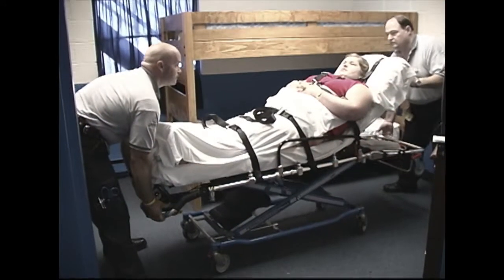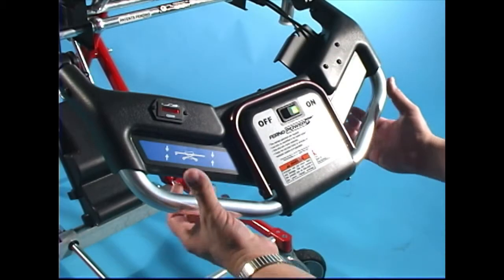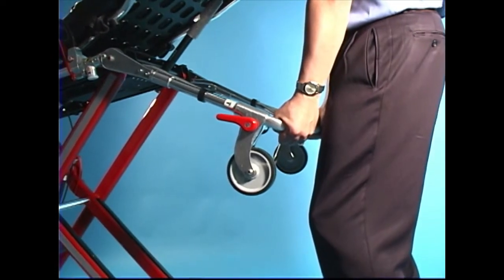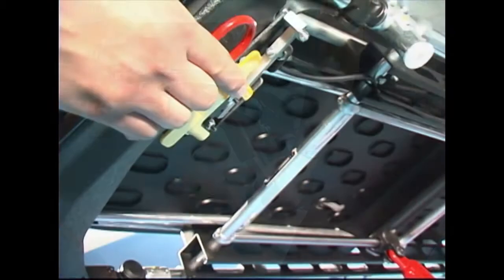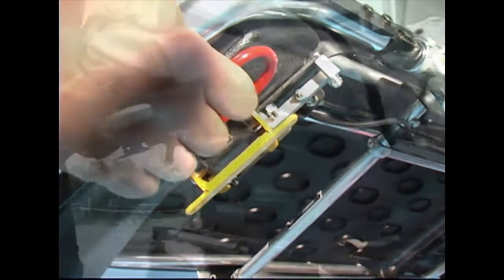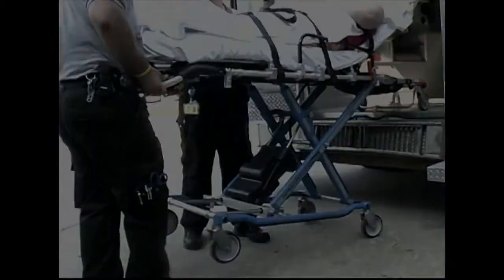To raise or lower the cot, both operators stand at opposite ends of the cot and use an underhand grip to grasp the main frame. Shorter operators can lower the drop frame and foot-end lift frame for better leverage. The PowerFlex includes a manual release handle to operate the cot in manual mode if needed. Consult the manual for guidelines on the proper use of the cot in manual mode.